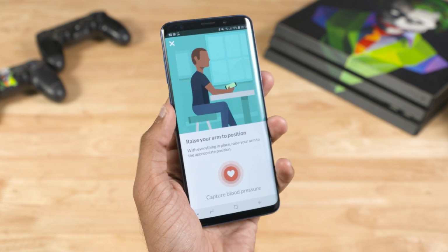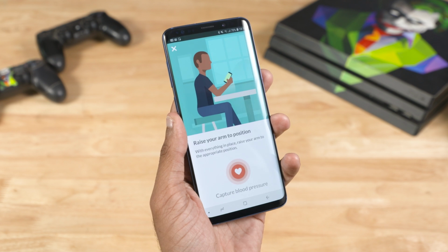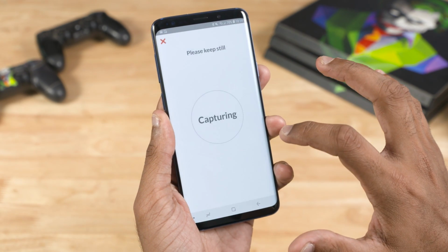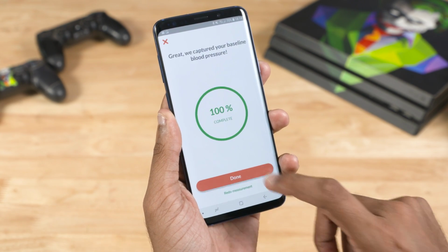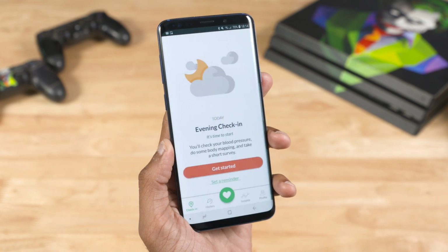Finally, raise the phone to a height of roughly where your heart is and keep your hands straight and hit the start button. Give the app the necessary permissions and hold still. It should take your BP reading within 20 seconds and there you go. You have a baseline reading and you can now start the journey towards understanding your stress patterns throughout the day.